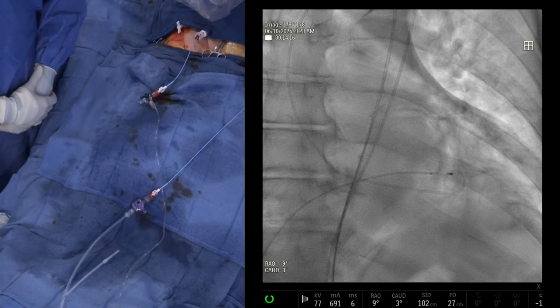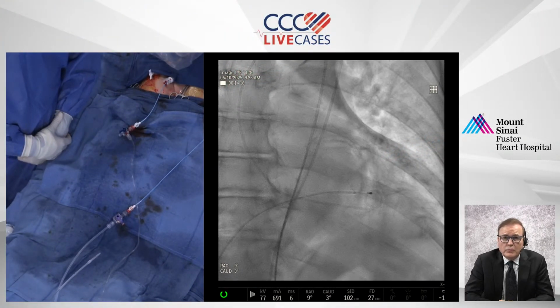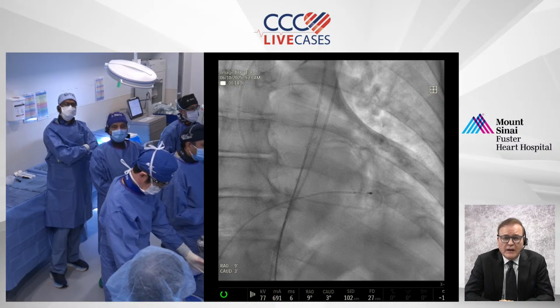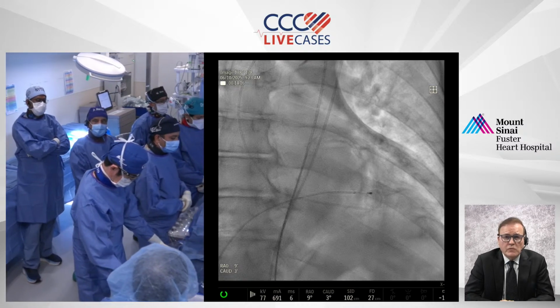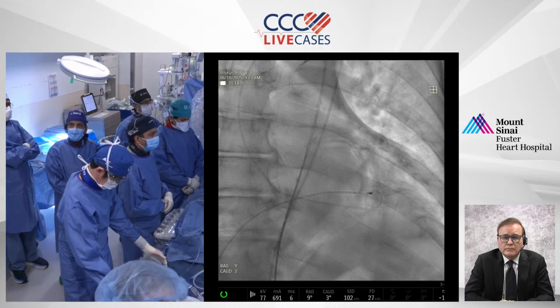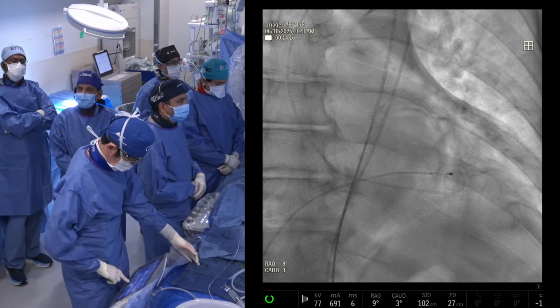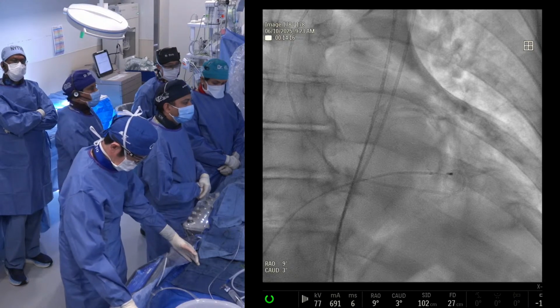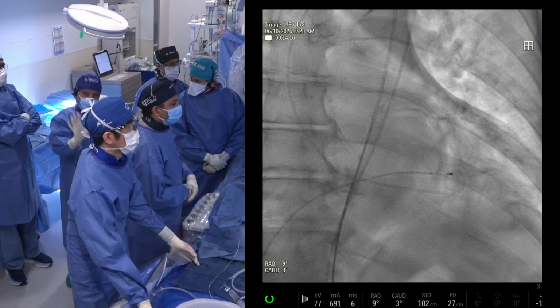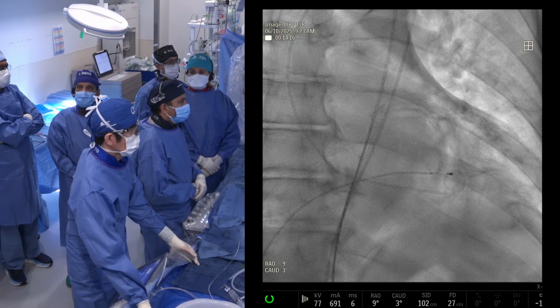Yeah. Just to finish on this question, let's assume left main and 3 vessel. Would you do the TAVR first, or would you do complex PCI with BAV? Yeah, so if we know about the CAD before, extensive CAD, our goal has been to do the BAV, do the PCI, and then bring the patient back 6 to 8 weeks later for TAVR. In this case, we did not do the BAV. Actually, this case was done outside. So they did a PCI and referred the patient for the TAVR here.